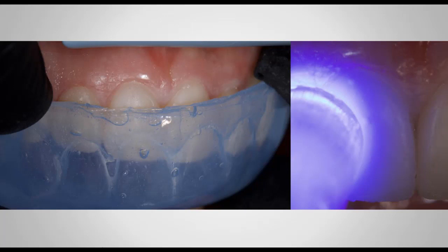Now, the third step is going to be removing the clear PVS. So now you remove the clear PVS. These flowable composites have received at this point 40 seconds of light, through a couple of millimeters of this clear triad and clear PVS, but now they're not going to go anywhere. They're solid. And now you're going to remove the clear PVS, and one more time you're going to cure directly on top of the flowable composite.